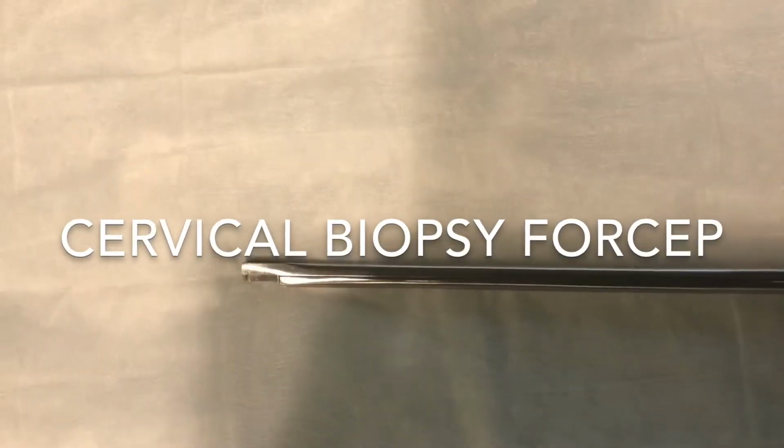So the uterus, fortunately, only knows how to feel one thing: a cramp. Basically, we are taking a little piece of the cervix or a few pieces. This is one of the different types of biopsy forceps that are used. Fortunately, the uterus only knows how to feel a cramp, so that is all you feel with this.